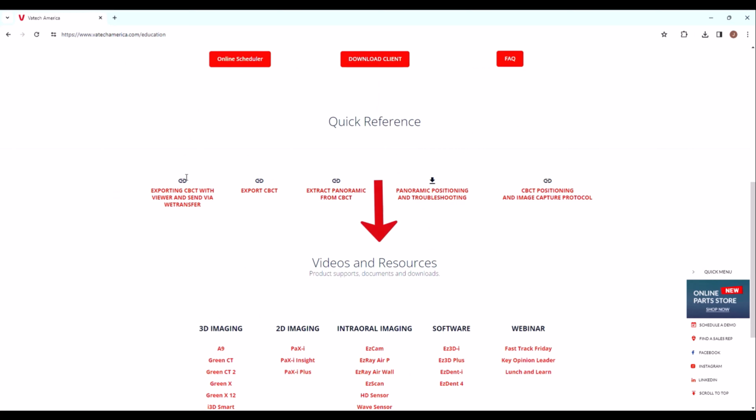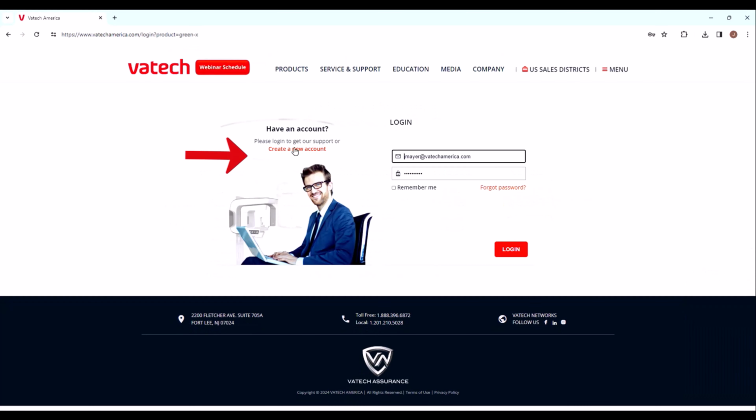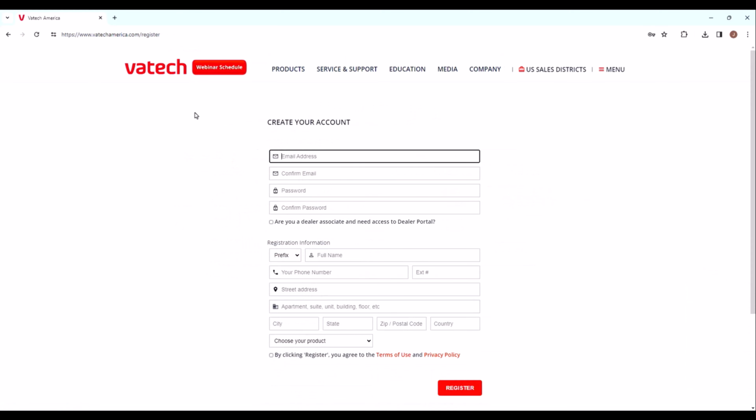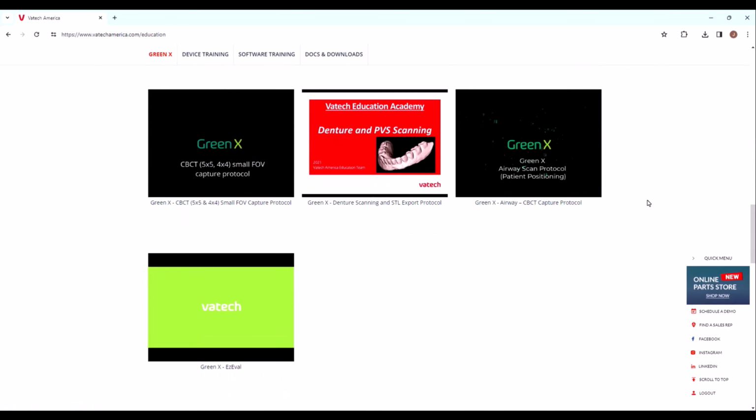Videos and resources. The bulk of our education modules are located here. Viewing left to right, you will find device video modules including imaging for 3D, 2D, and intraoral tutorials, followed by software modules, and finally recorded webinars, which include past lunch and learn sessions and clinical partner sessions with industry key opinion leaders. To access, simply select your area of interest and create your account. Selecting a device or software option navigates you to the training modules.